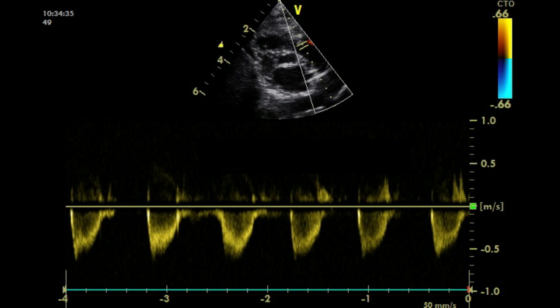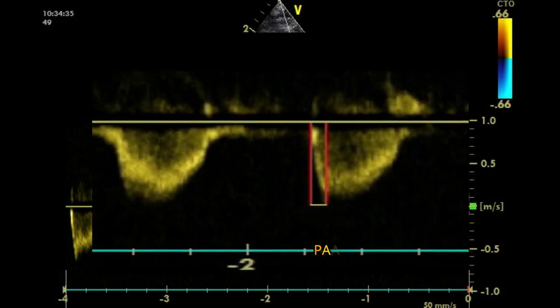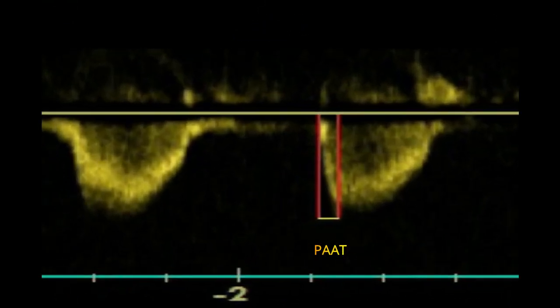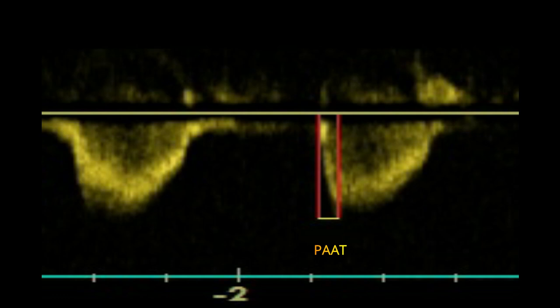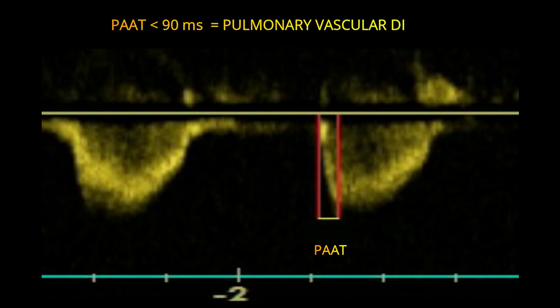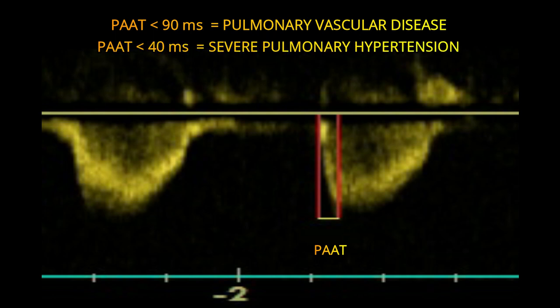Pulmonary vascular resistance can be assessed by measuring right ventricle systolic time intervals, such as the pulmonary artery acceleration time. This index has recently been validated as a feasible and reproducible non-invasive echocardiographic imaging marker for detection of pulmonary vascular disease and pulmonary hypertension in neonates and children. A value below 90 milliseconds reliably detects pulmonary vascular disease, while below 40 milliseconds detects severe pulmonary hypertension.